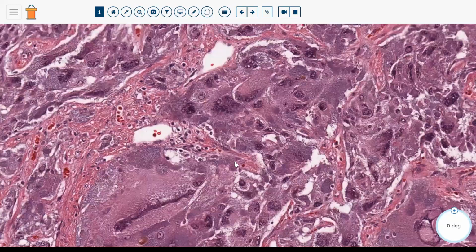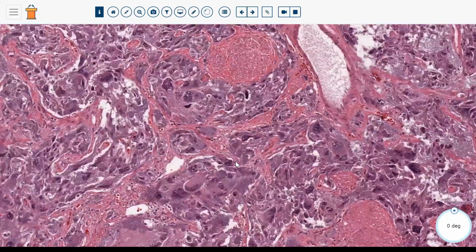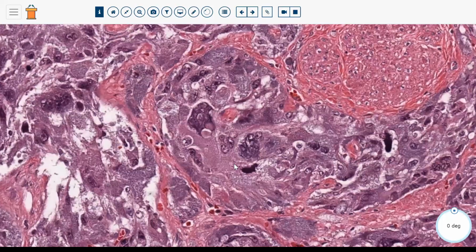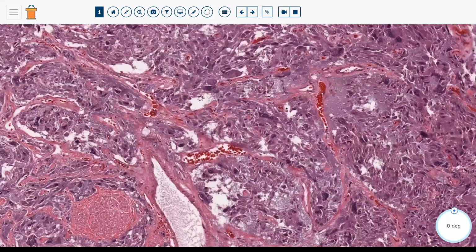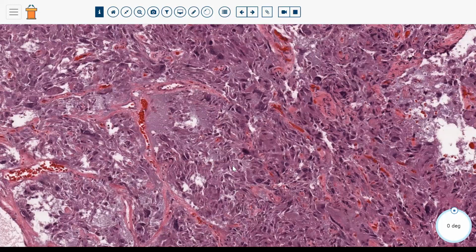It's certainly possible that you can have this degree of pleomorphism in a pheochromocytoma. And if you look into the literature on these, you might find that there are various proposals for criteria to predict the malignant behavior of pheochromocytomas. One that's fairly well known and fairly popular is the PASS system, P-A-S-S, which stands for pheochromocytoma of the adrenal gland scaled score.